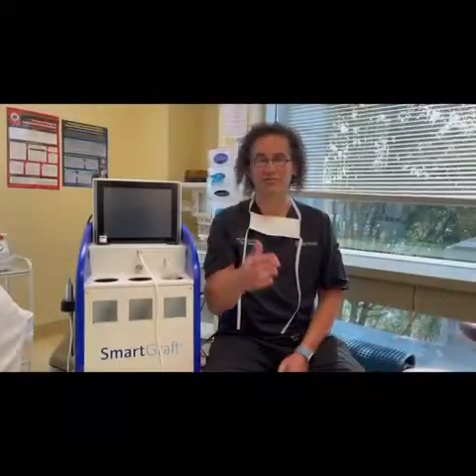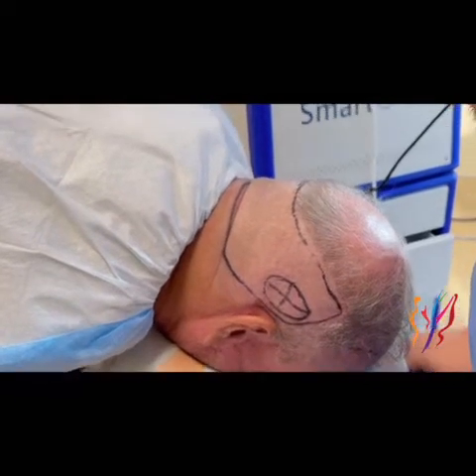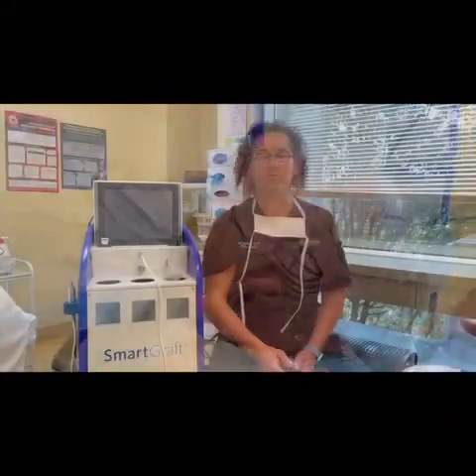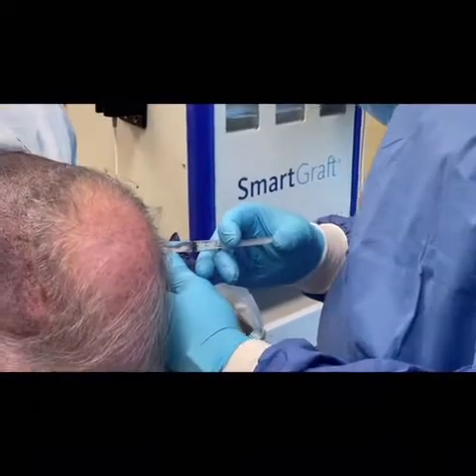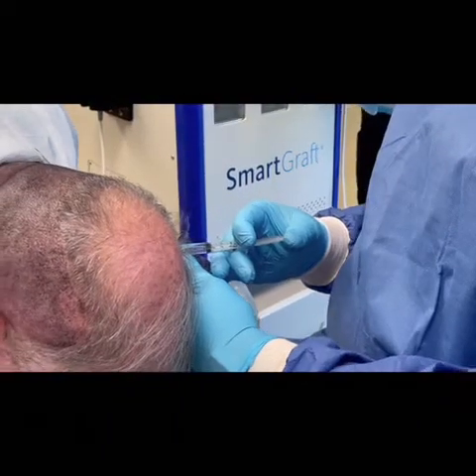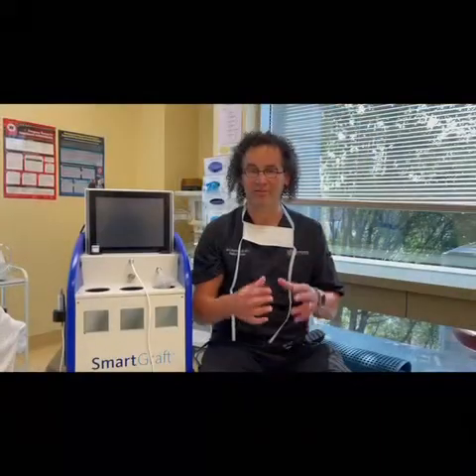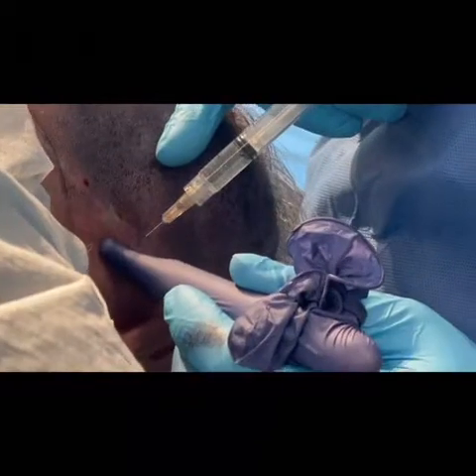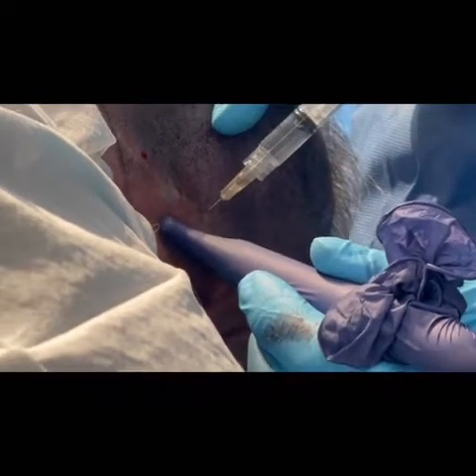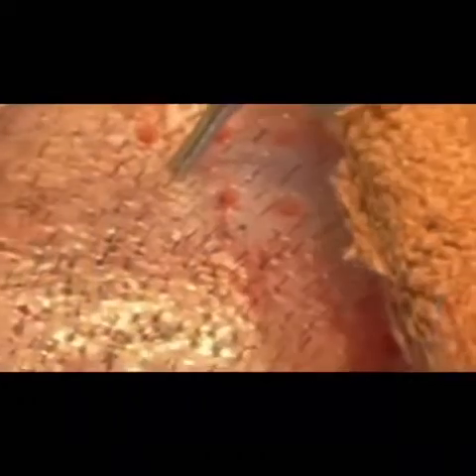The procedure begins with you lying usually face down, we call that prone, and the hair has already been shaved, so what we'll do next is localize the area. When we talk about localization, we talk about injecting lidocaine, which is a medication to numb the tissue. It also contains epinephrine, a solution that helps the tissue vasoconstrict. We can actually watch your scalp blanch. The epinephrine is constricting the blood flow, so throughout the procedure, it is bloodless.